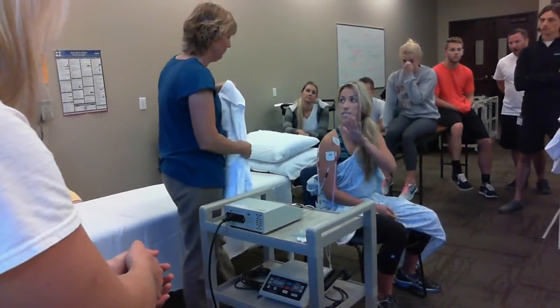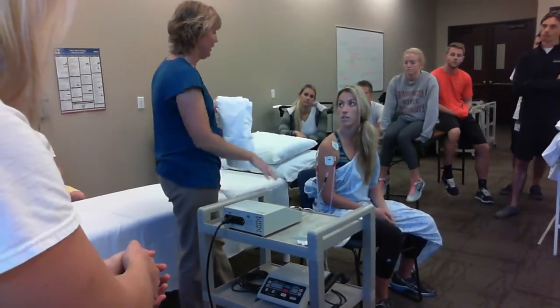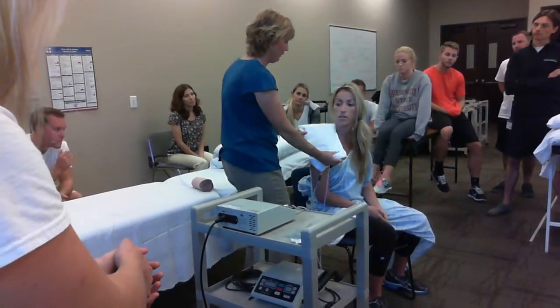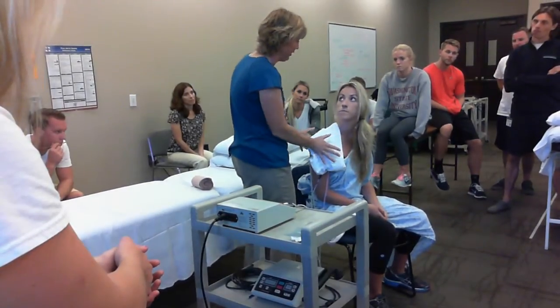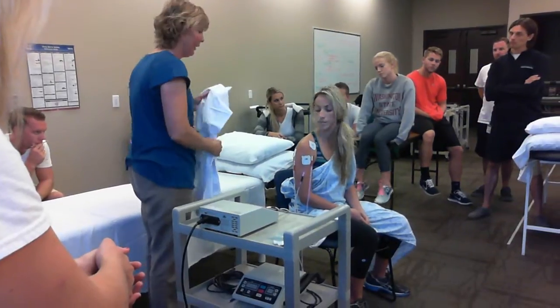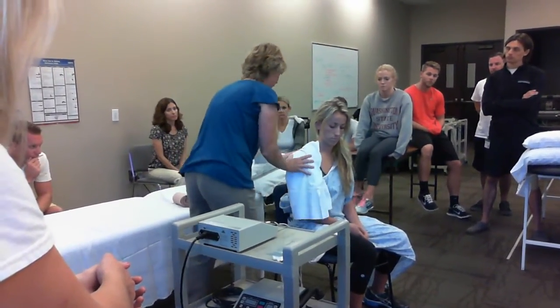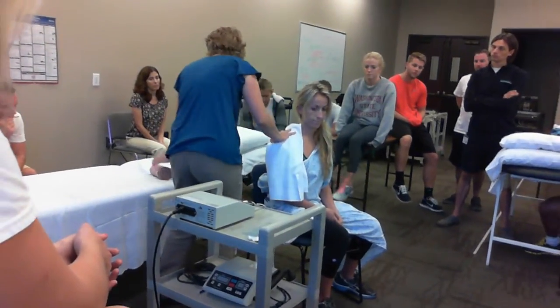Does it change the intensity when you're pressing harder? It can, yes, you're absolutely right. So if I did start this first, when I am doing it, I want to make sure that I wouldn't press down on it really hard and increase that current flow. Okay. All right, so I'll apply the cold pack first. I'm really comfortable that Lily understands that I only want a tingling sensation.